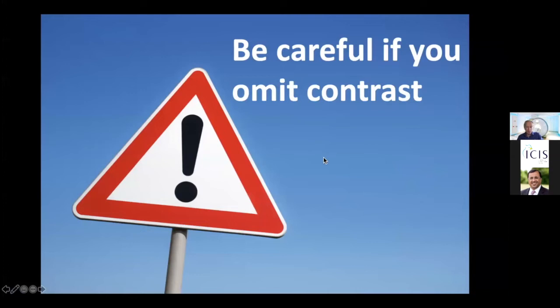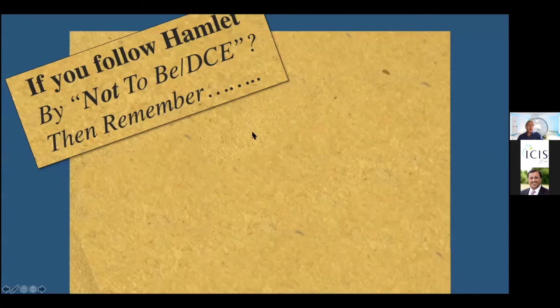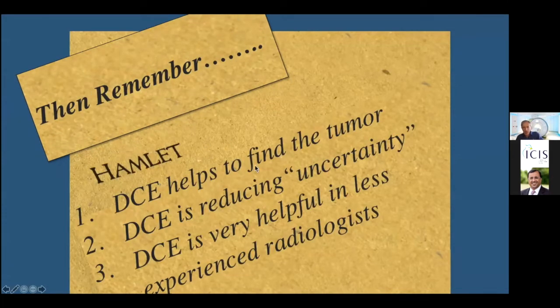Be careful if you omit contrast. And if you follow Hamlet, by not to be, finally he committed suicide. So by not using contrast, not to DCE, please remember, DCE helps to find a tumor. DCE is reducing uncertainty, and DCE is very helpful for less experienced radiologists.